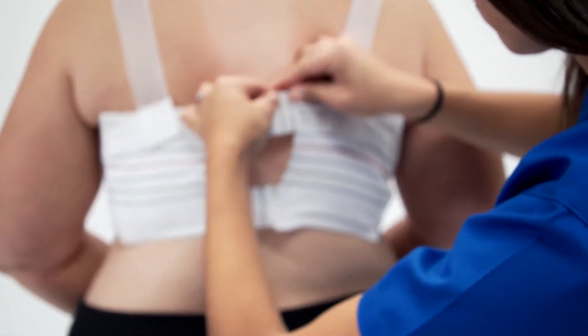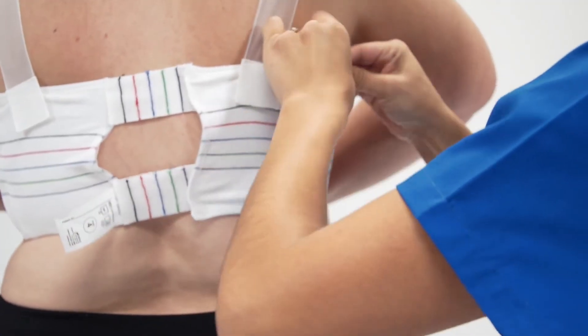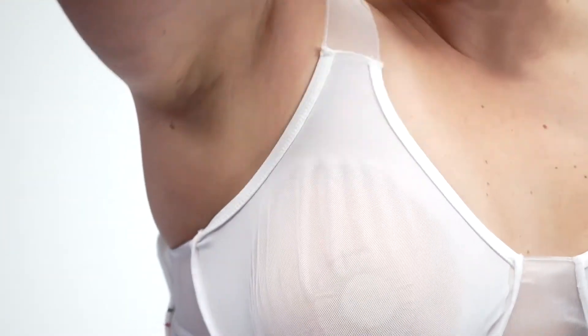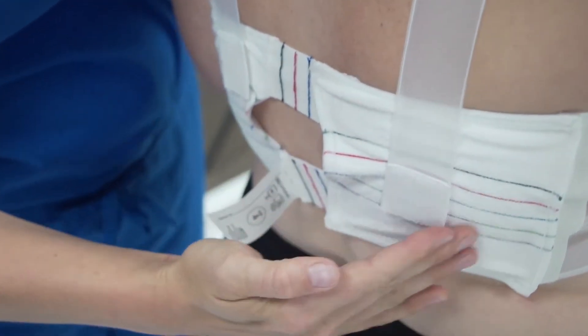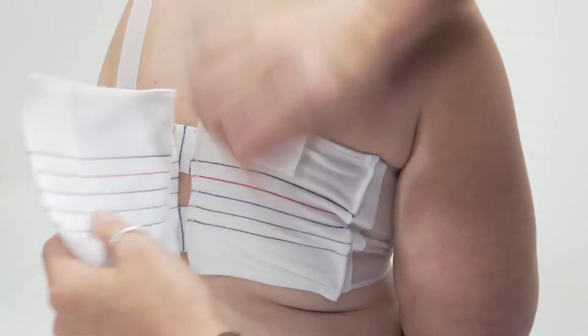Once your patient enters the room for simulation, adjust the bra using the Velcro straps. You may loosen or tighten the width of the bra, and loosen or tighten the shoulder straps. Have your patient raise her arm on the affected side during this process and tighten the bra strap accordingly. A bra extender is available if the size around the circumference is not large enough, but the cups fit.